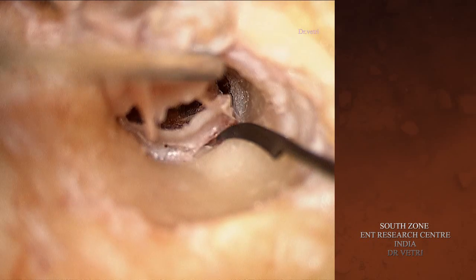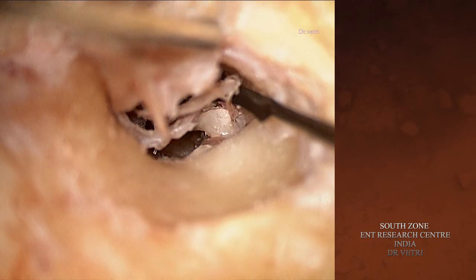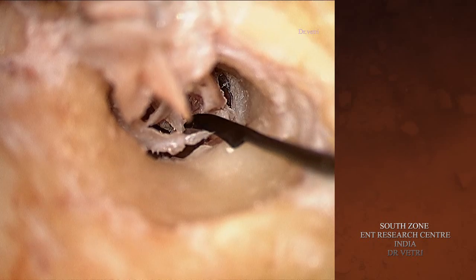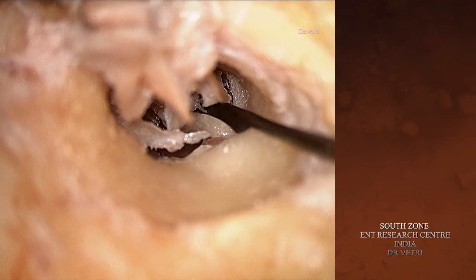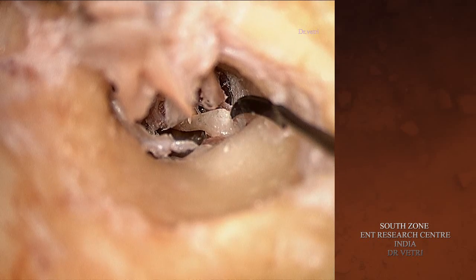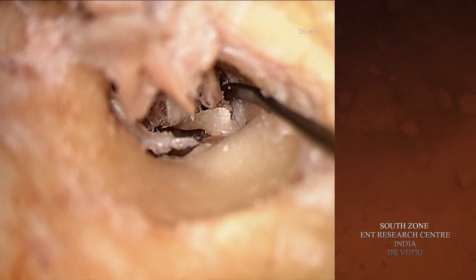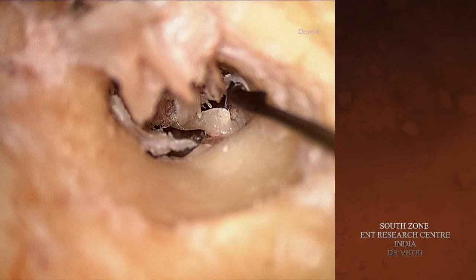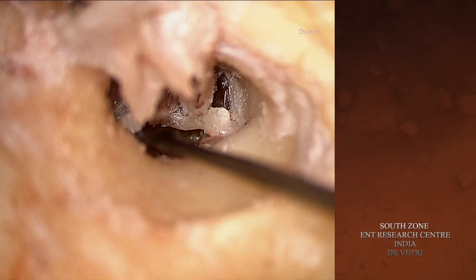And now the posterior skin flap is elevated up to the notch of Rivinus, to the posterior malleolar ligament, superior to which there is no annulus. You can see the detached end of the annulus posteriorly.